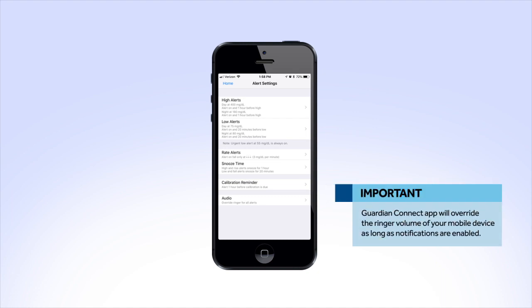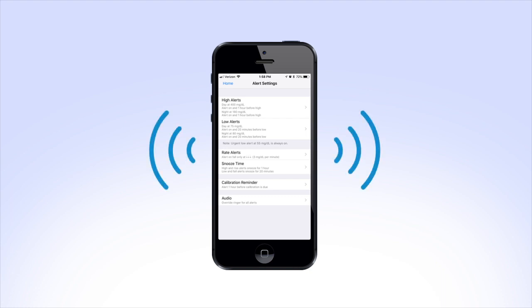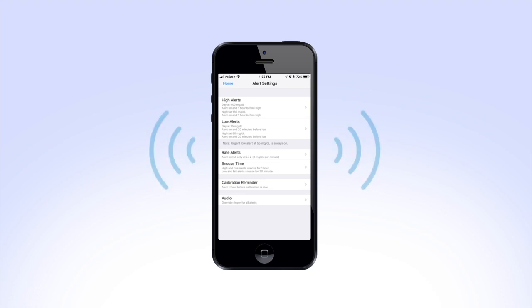It's important to note that your Guardian Connect app will override the ringer volume of your mobile device as long as notifications are enabled for the Guardian Connect app. This feature, called Audio Override, is already turned on for all app alerts when you first start using your app. This means that the app will alert you at maximum volume, even if your mobile device's ringer volume is set to Do Not Disturb, Low Volume, or Silent.